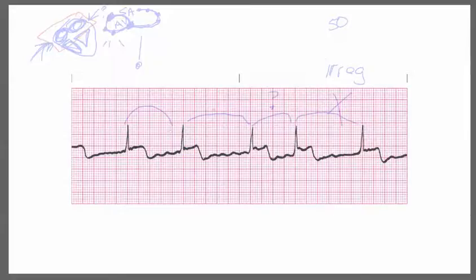So you're gonna find what you recognize - we always start by finding a QRS complex and we're gonna look before it and we're like 'holy crap, what is all this?' And then you look here and you're like, well let's compare it against something else. And then you're like, oh well, let's look at this. None of these have the same appearance, there's no pattern, there's no sawtooth.